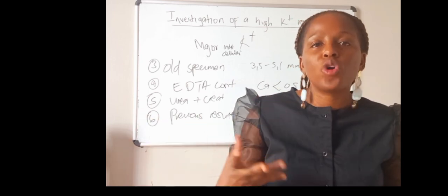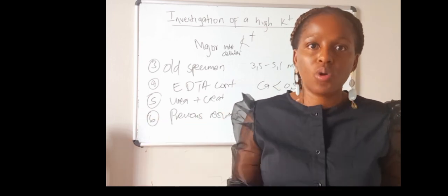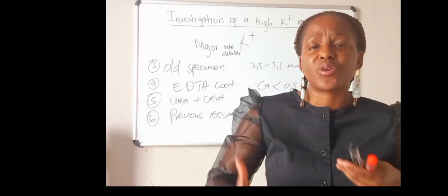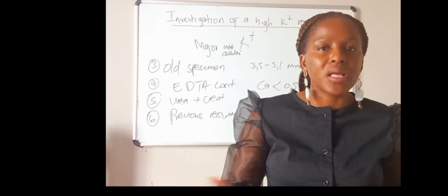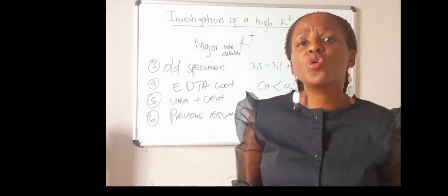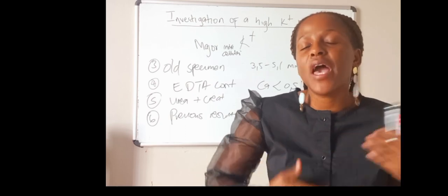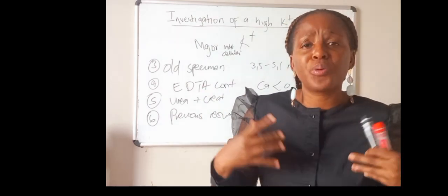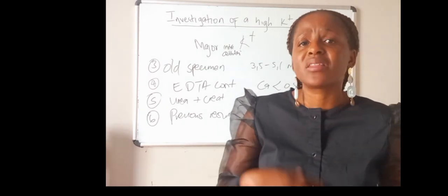So this might be because this patient is a known patient. But above all, you need to follow your lab's protocol, because some labs, especially with regards to hemolysis, have a grading for when you start to panic, whether it is 1+, 2+, or 3+. You will just have to follow that, and the comments that you need to put in, if any.